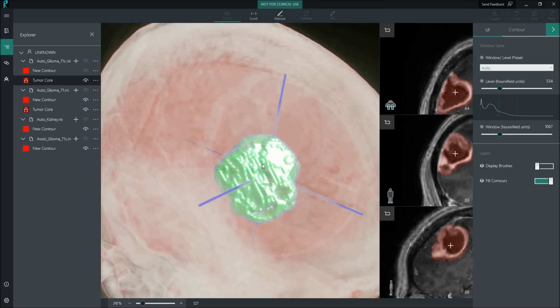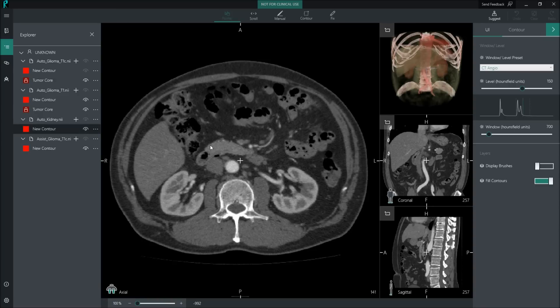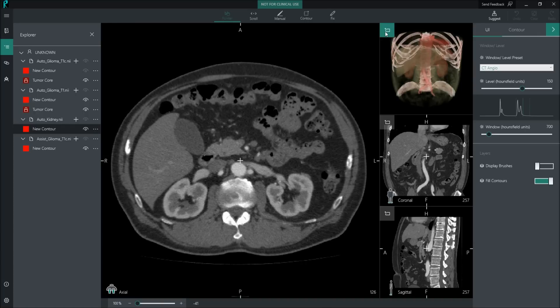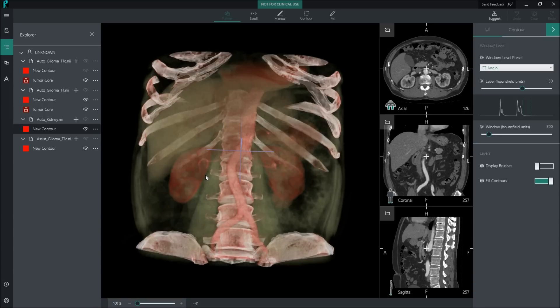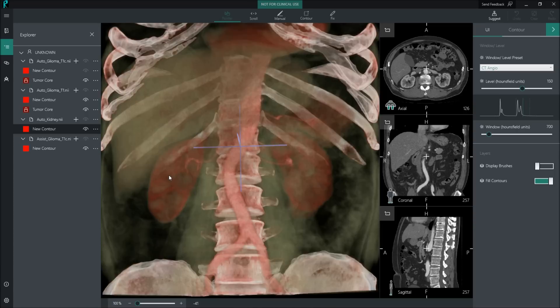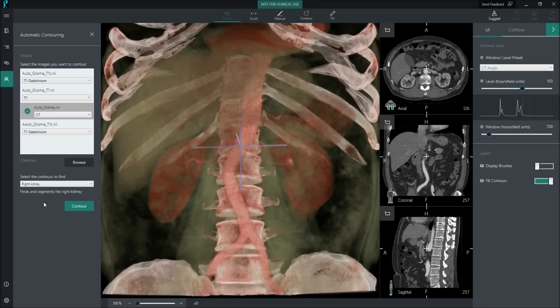The reason why the preparation takes so much time is because when Raj does the radiotherapy planning, he needs to segment not just the tumours, but also nearby healthy organs. They need to be protected from damaging radiation — they're called organs at risk. For instance, they could be the liver or the kidneys that we can see here, or the spine. We might want to minimise radiation in the kidneys or the spine.